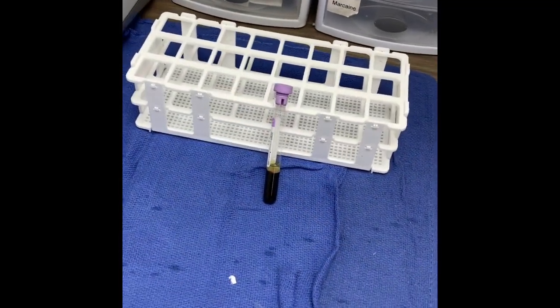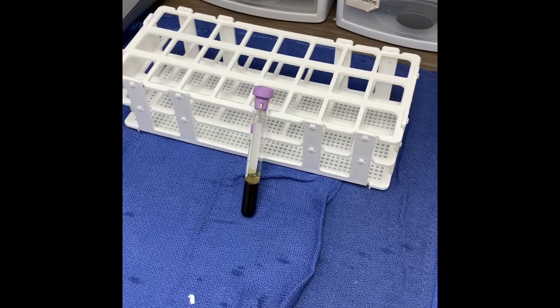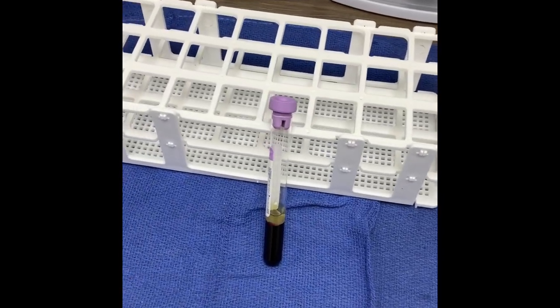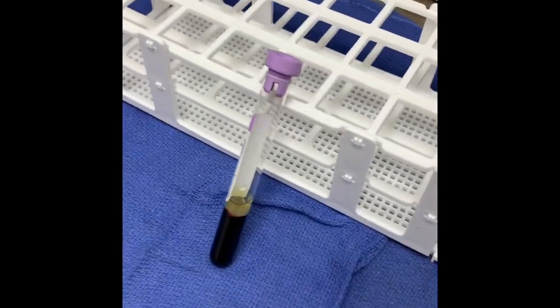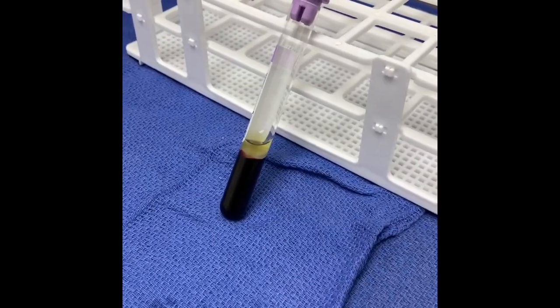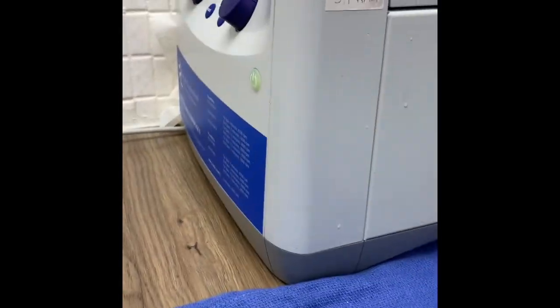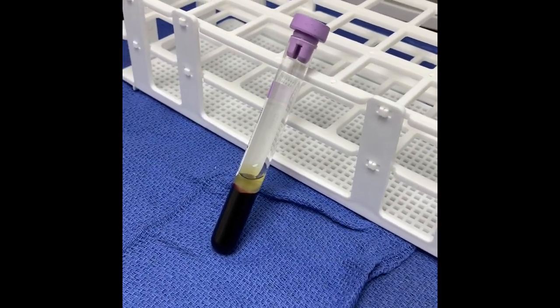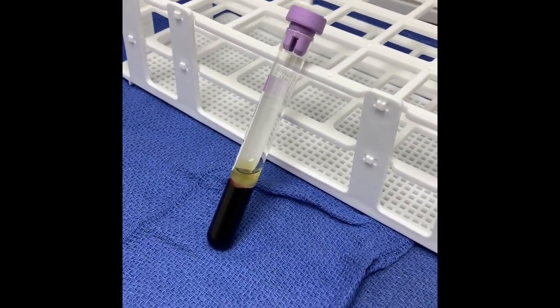So I'm gonna go ahead and edit this into the last part of the video. This is one of 5 tubes that we isolated blood from the patient. And as everyone can see, we have our centrifuge right here. This is where we spin the blood, and they just went ahead and threw away 4. This is a 5th tube.